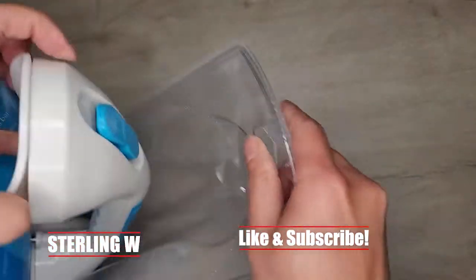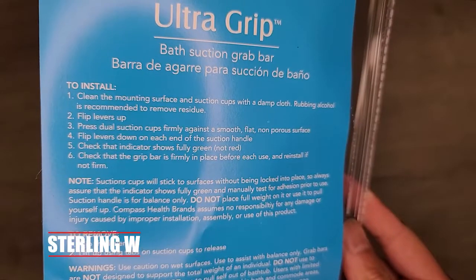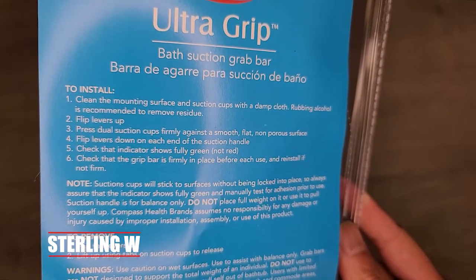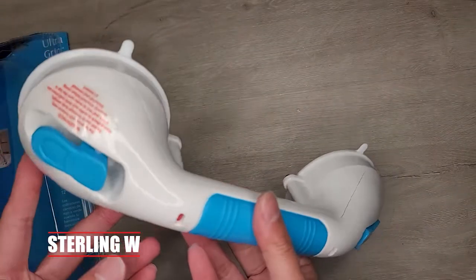The hardest part, of course, is taking this thing out of the packaging. The blister pack is kind of difficult to open and take apart. The instructions say to basically use some alcohol to clean the surface, and then you basically flip those little switches to lock it in.